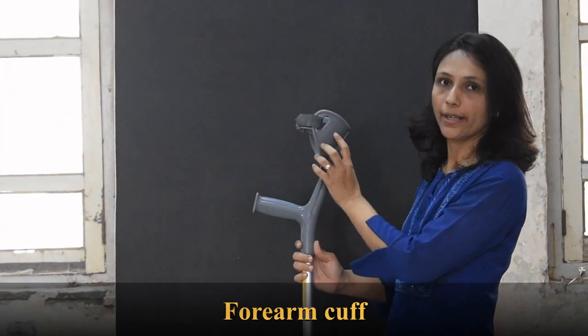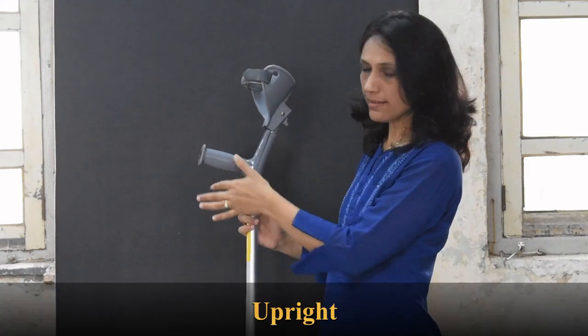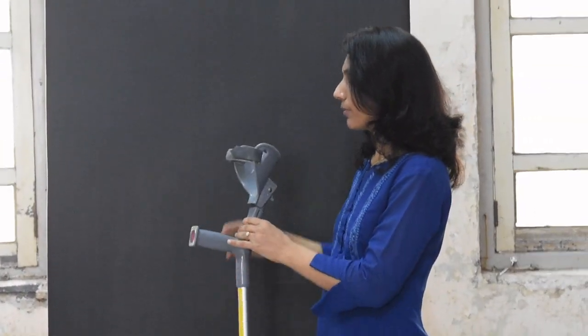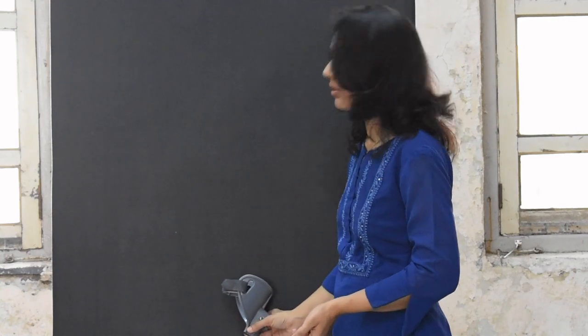This is the forearm band or forearm cuff. Then you have the hand piece, then you have the single upright, and at the bottom you have the rubber crutch tip. This forearm crutch is also called as Lofstrand and Canadian crutch.